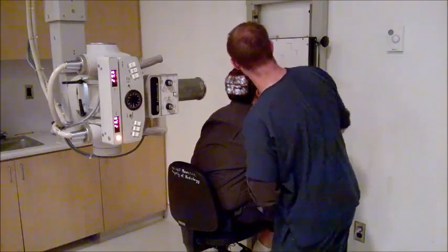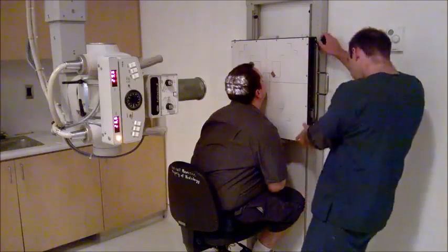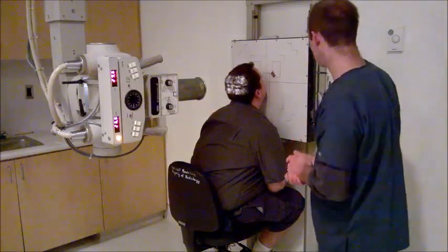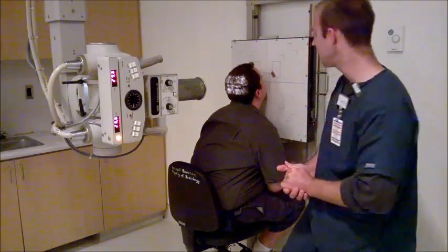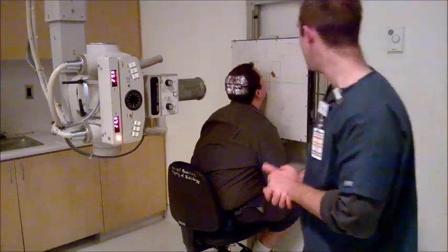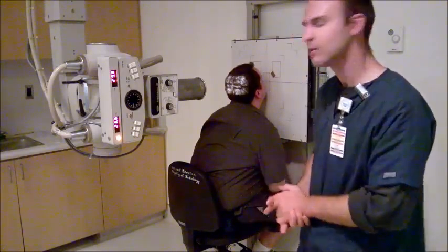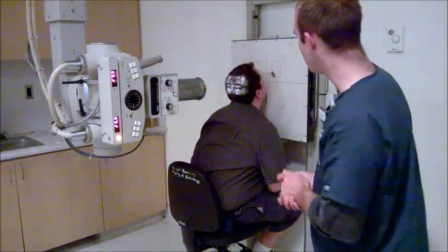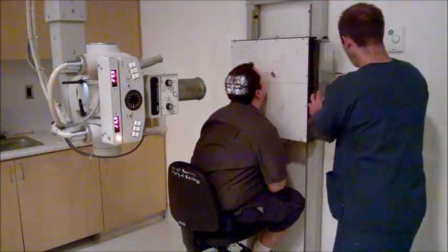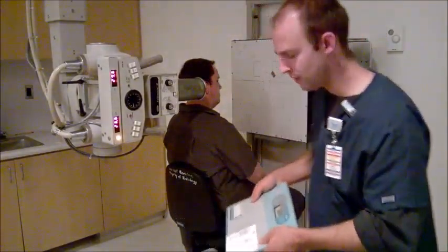So put your marker, that's my right marker on there on the right side. All right. It's at the level of mid-orbit or the nasion. And I would take this at a little bit higher. So it would be 70 kV at 25 mAs, because it's going through more matter. Okay, beat of course, and then I would take this, scan it, and read it, and if it's good.